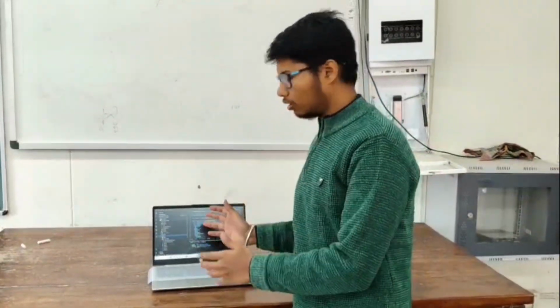We have designed a wirelessly enabled medical dispensing system. Let's show how it's done. So this is the whole structure of our code.